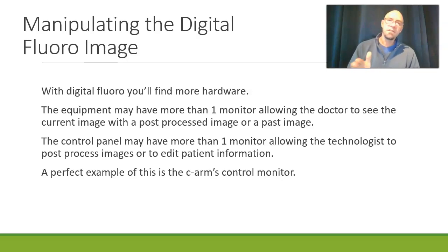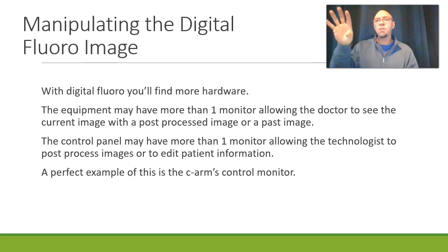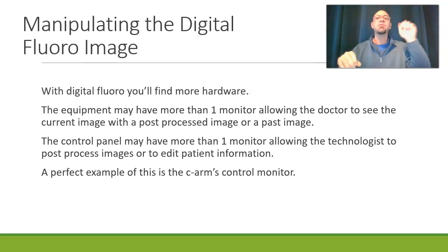When we're dealing with the C-arm, or if we're dealing with interventional, then yeah, we might be intervening. So let's pretend in interventional we have a clogged popliteal artery in someone's leg. One of the issues might be when we introduce contrast that we see that blockage. Well, we might want to see that cine loop over and over again, and we can show that on one monitor. And on another monitor, maybe we can see the progress that we've made. Maybe we've injected a clot-busting drug, or maybe we have put in a stent, or maybe we actually just tried to push through that thrombus.